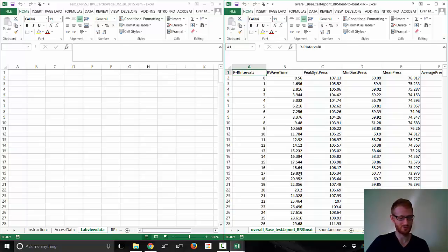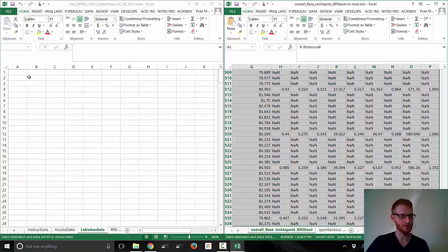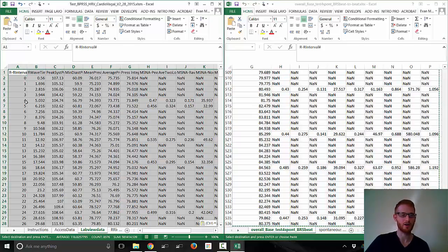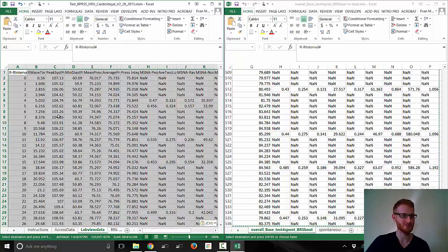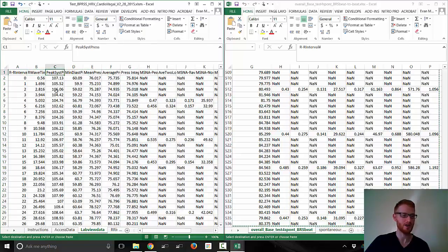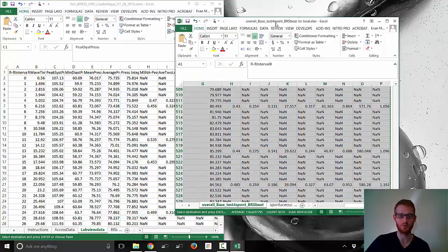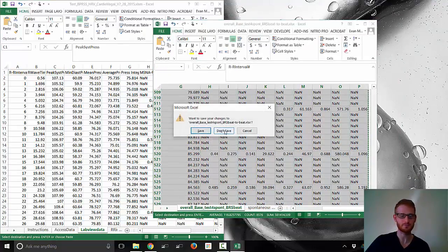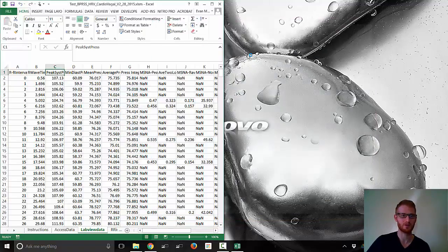We're just going to highlight it all — Ctrl-A, then Ctrl-C to copy, and just put it all right there. This template file is looking for this data in this order and in this format. If for whatever reason you only had R-wave time and peak systolic blood pressure for each cardiac cycle, you could simply put those here with some sort of header title and the template would still work. It's just that I set this up specifically to work with this data. So once this data is in, we no longer need this open, so we're going to close out of this.